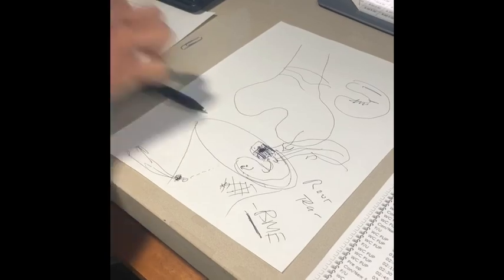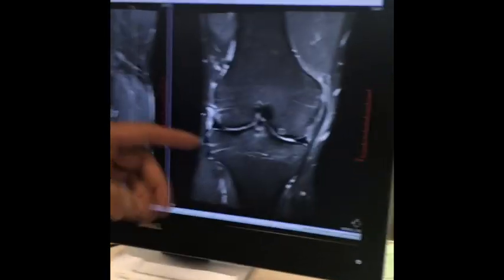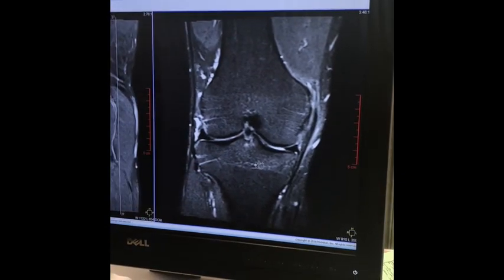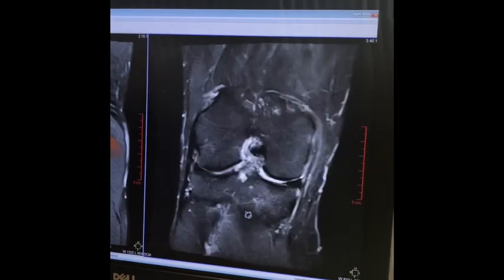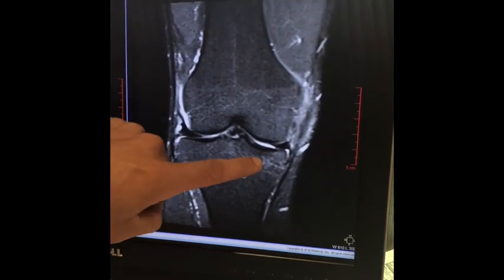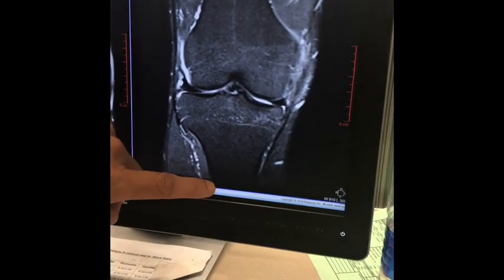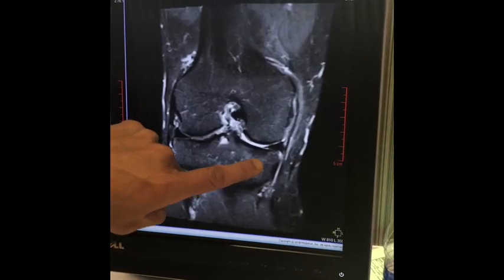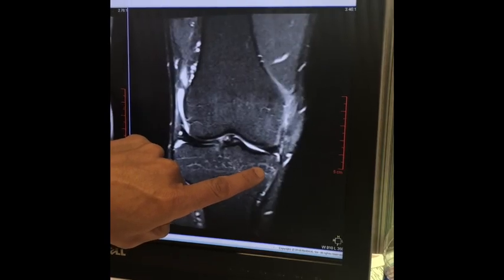So that's what we're going to do. We're going to look at the MRI right over here. And so we're going to start in this view right here. This is the coronal view. Now, I look for bone marrow edema here because this is the plateau. So if you look at this and then look down over here, this area is this area. Now, in this case, I do not see bone marrow edema.